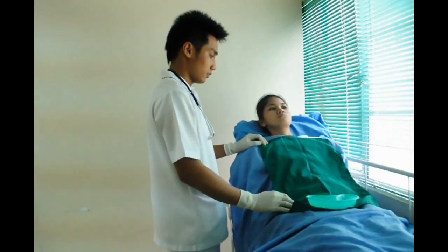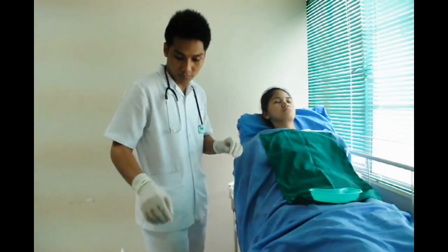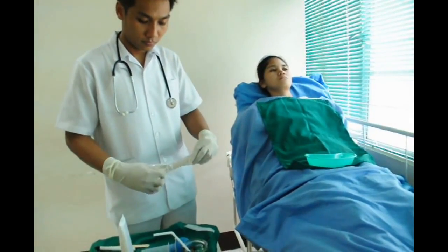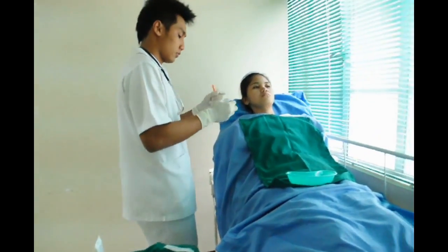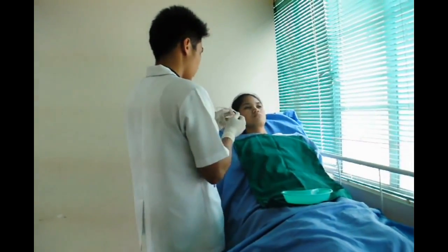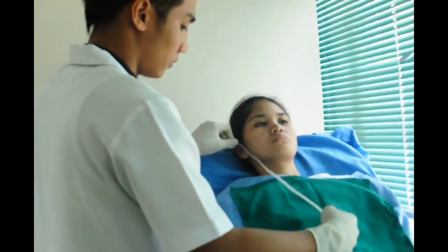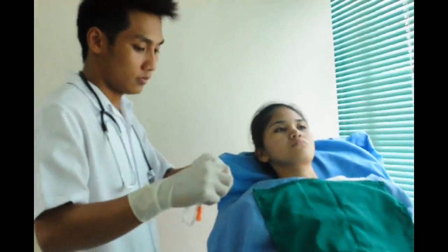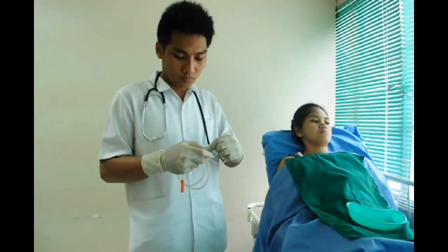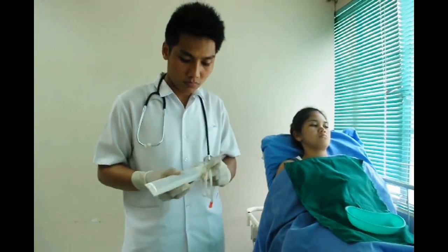Nurse Christian is going to measure the distance to insert the tube by placing the tip of the tube at the patient's nostril and extending to the tip of the earlobe, and then to the tip of the xiphoid process. The measurement ensures that the tube will be long enough to enter the patient's stomach. Mark this with an adhesive tape. Lubricate the tube tip at least 2 to 4 inches. Lubrication reduces friction and facilitates passage.